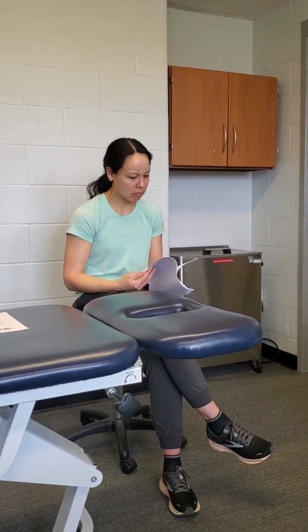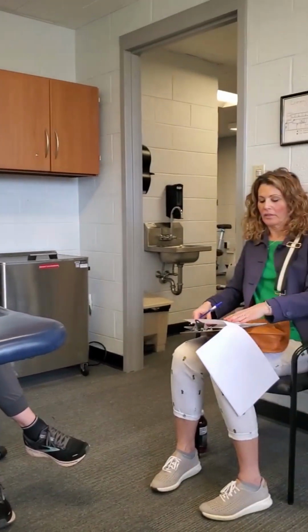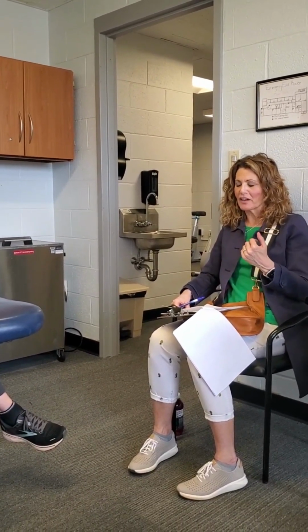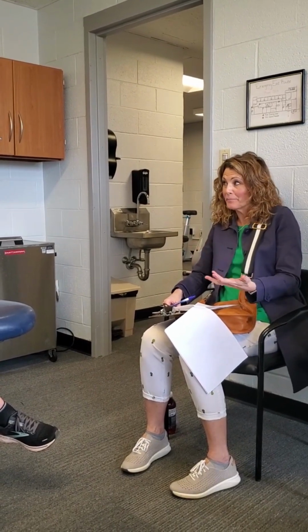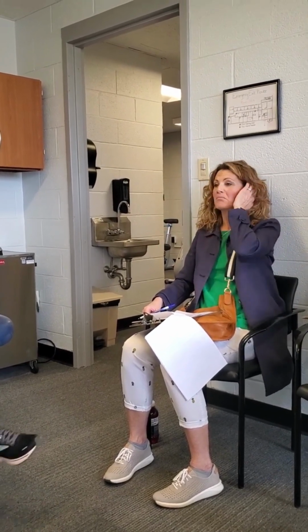Sorry, I know I kind of flew through some of that. But along the lines of the Parkinson's, most of them start with a one-sided weakness that then becomes bilateral. I'm even thinking about the woman I have right now. I assume you would put the BFR on the more affected limb. Probably, yeah. But when they talk about Parkinson's, they're noticing bilateral change, even when the device is on one side. Right, correct.